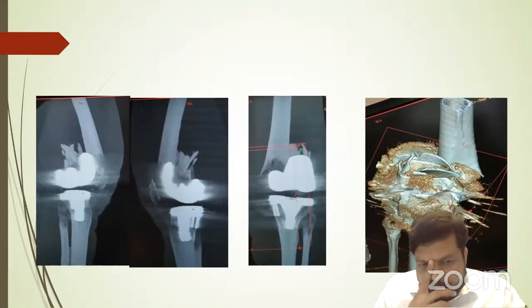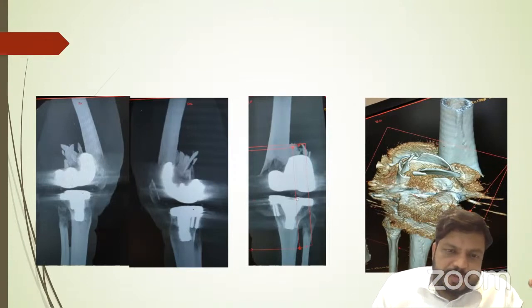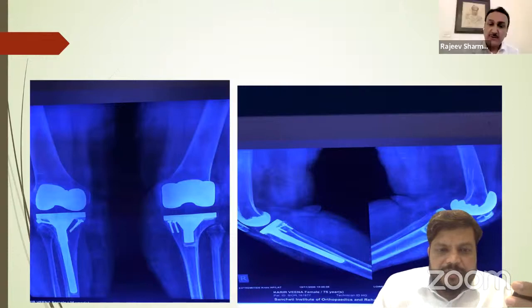About this case, I would like to ask the panelists what the options are. Would you fix it and rehab, or go for replacement? Dr. Gaurav, before we decide the fixation method, let us try to read the preoperative or immediately postoperative x-rays. Can you go back to your slide? Yes, sir. So these are before the fracture.